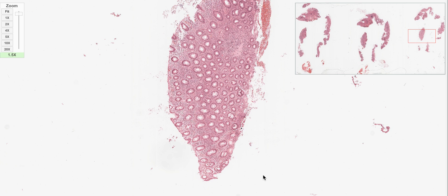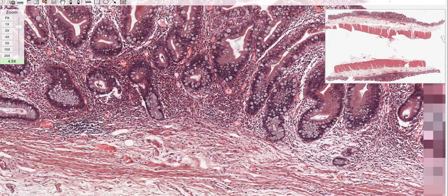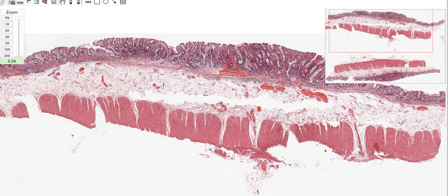What we are seeing here is an endoscopic biopsy of the colon - you can see the colon is in bits and pieces. The disadvantage of an endoscopic biopsy is I will not see the muscularis propria, the transverse and circular muscles, or the serosa, because when plucking from inside the intestine you don't want to perforate it. So I'm going to have only the mucosa, lamina propria, maximum to the submucosal layer. Another biopsy from a resection specimen shows the mucosa, submucosa, lamina propria, and the muscularis transversus - the circular muscles.